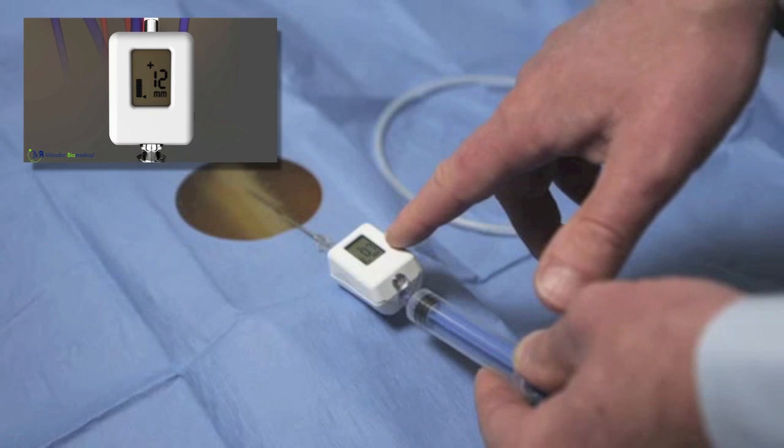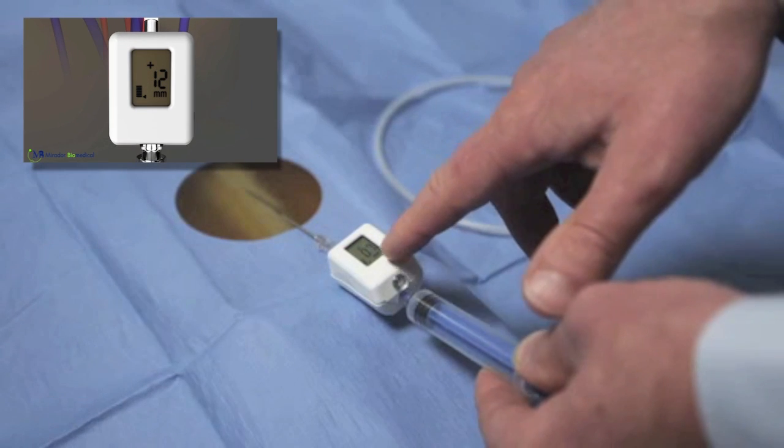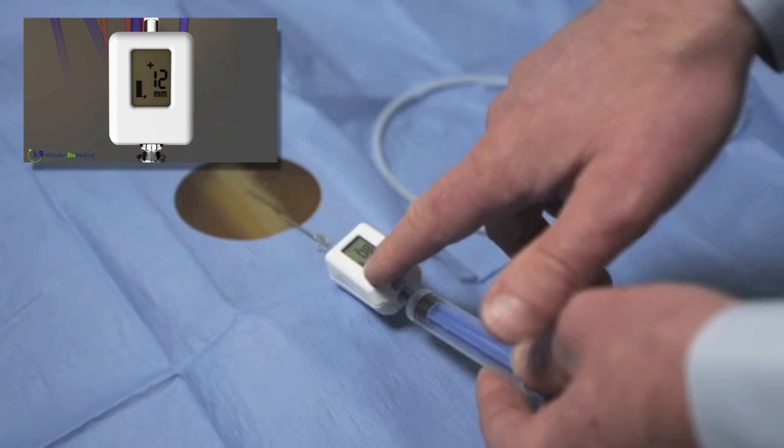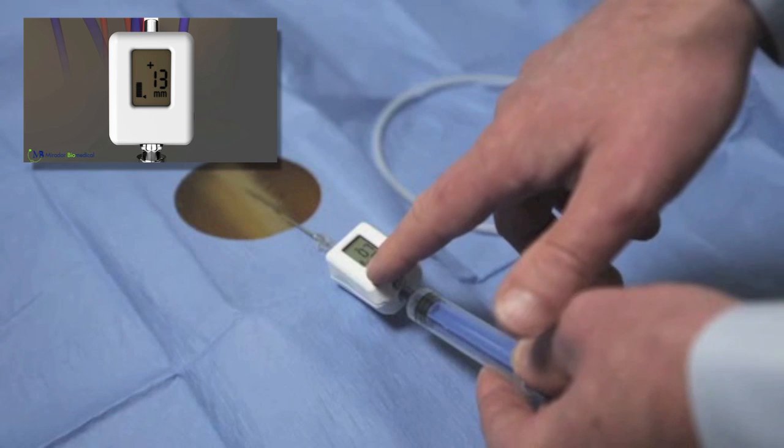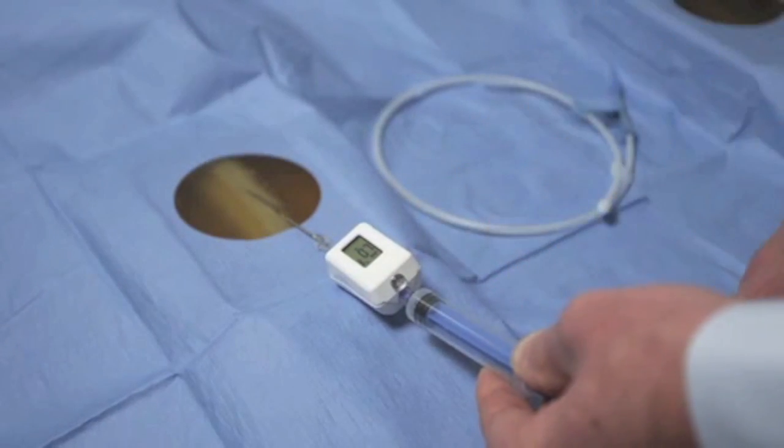You'll see the average pressure displayed as the number, and next to it you'll see a representation of the waveform, where you'll see respiratory variation.